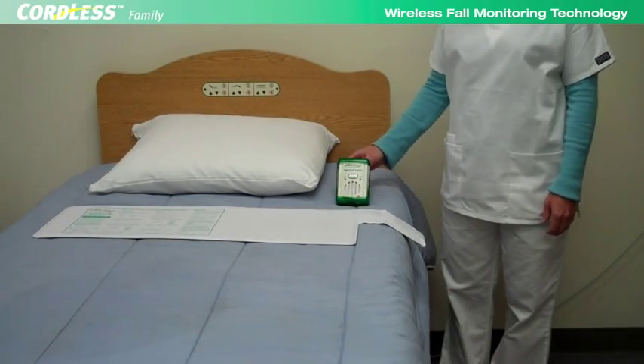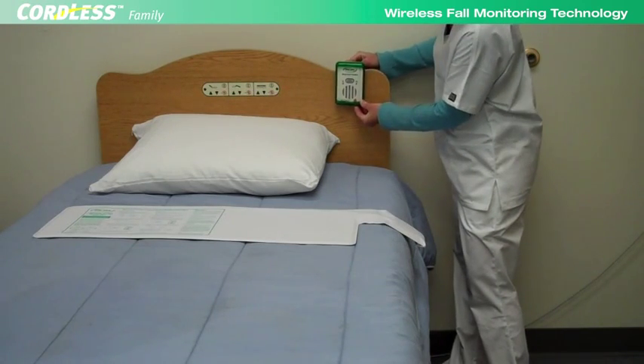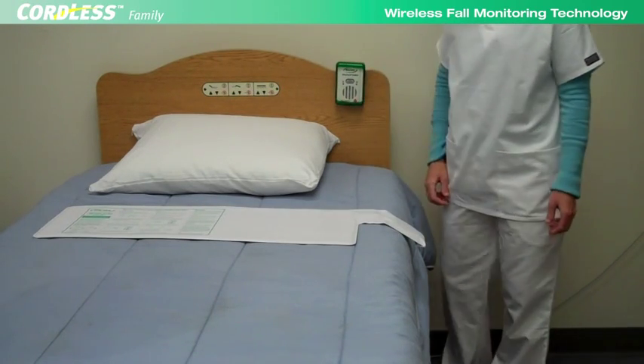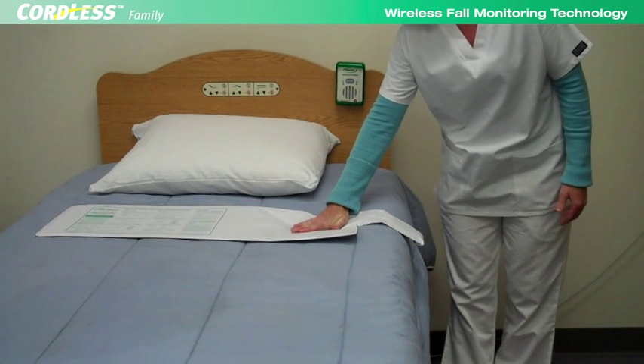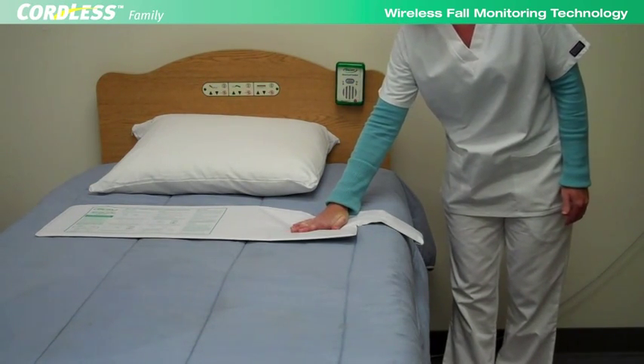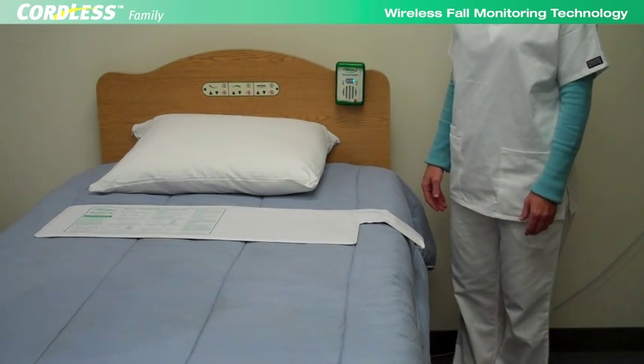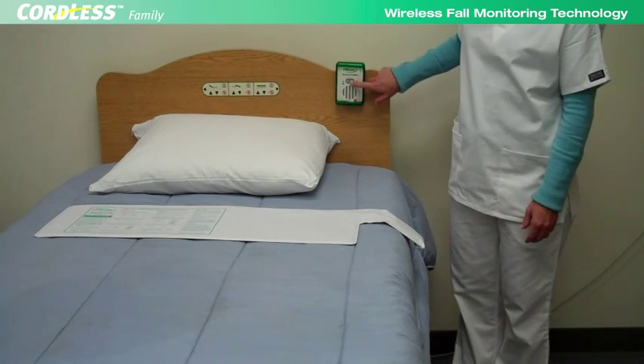Always test the cordless system before using it with a resident. Place pressure on the cordless sensor pad. Two short beeps indicate that the system is functioning properly. Releasing pressure from the pad will set off the alarm. Reset the alarm by pressing the reset button.